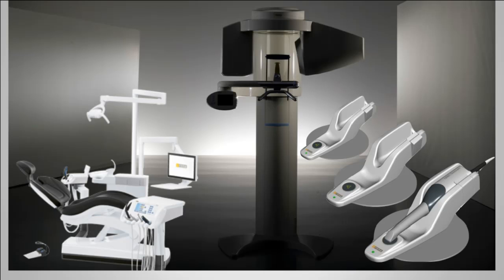Now, I will be sharing a unique workflow that's exclusive to Dentsply Sirona and to Megagen, but certainly there are other cone beams and other CAD/CAM systems that also allow for integration, and certainly there are other methodologies in restoring implants from start to finish using chairside CAD/CAM.